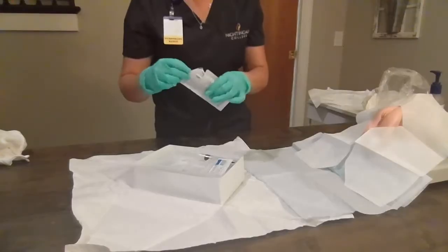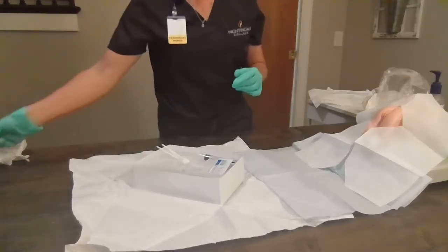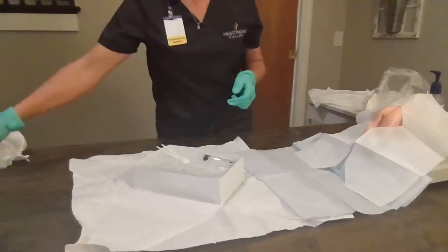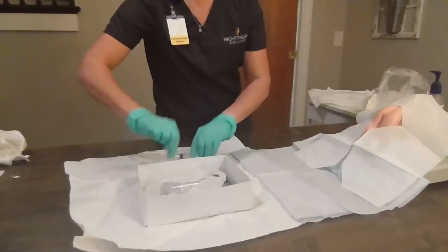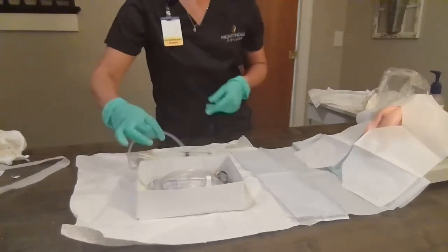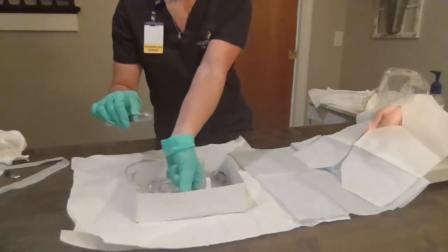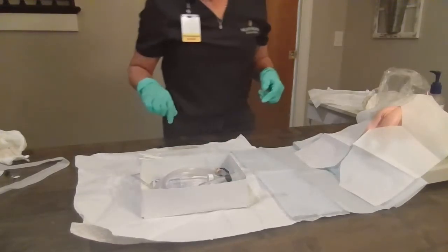I'm going to pull out my alcohol swabs and place those in easy reach. Open up my lube and apply that. Then we're going to pull out our Foley and lube the tip. We are going to attach our syringe, making sure that we have a 10 cc syringe with fluid.